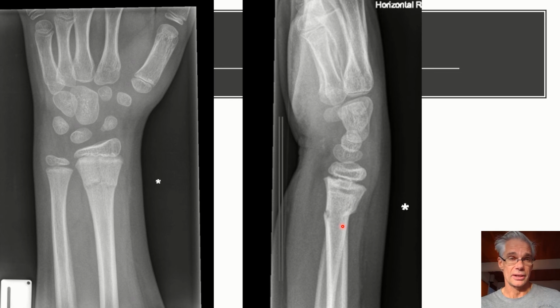The point for this tutorial is you can see the angle on a scan. So you can get them back at a week, scan them, measure it on the scan, freeze the image, put your measuring instrument on there, and decide whether it's acceptable or not. And I'll leave that up to you to decide in this case.